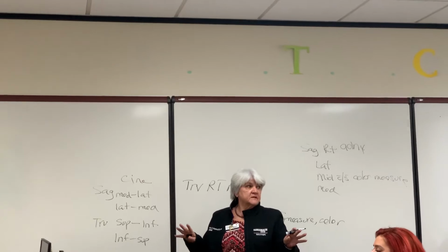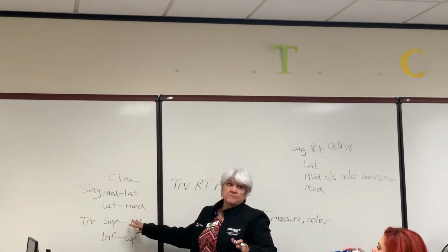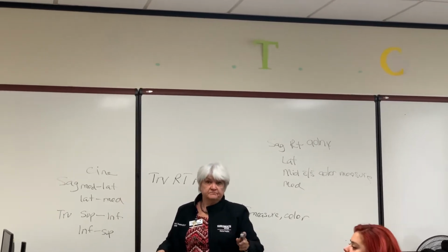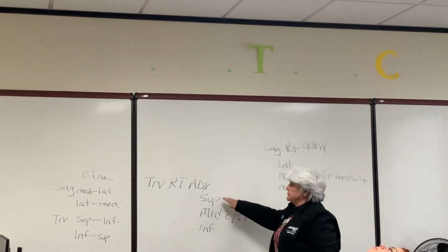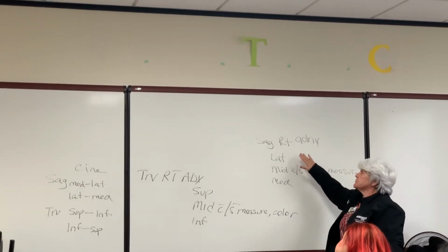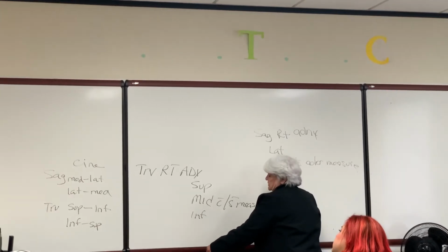That's the hardest thing to remember as a new sonographer, because you want to find that ovary. You won't be able to see the ovary. Just give it up, do a cine, and go to the next thing. But you still have to do your superior, mid, with and without measurements, with and without color, and then your inferior, then your sagittal. And you can either start medial or lateral to medial. It doesn't matter, as long as you cut the organ the way that it should.